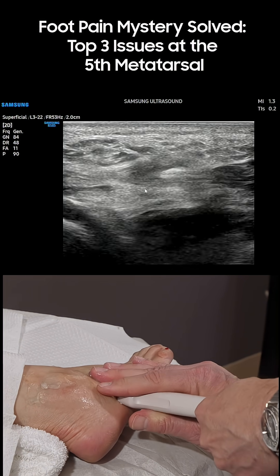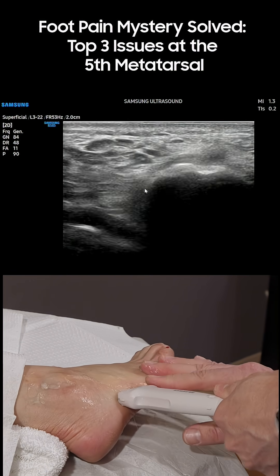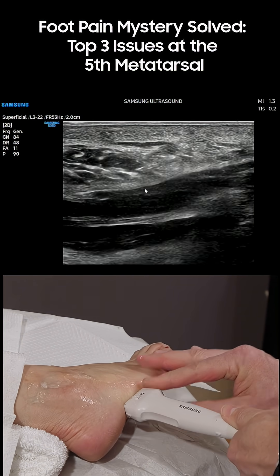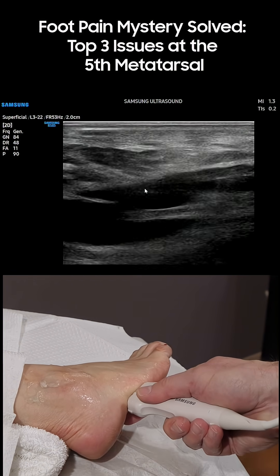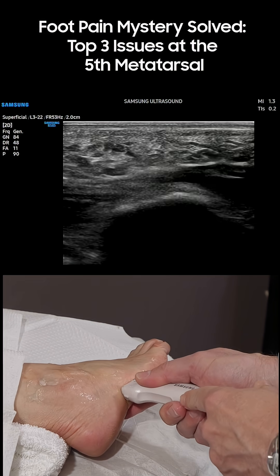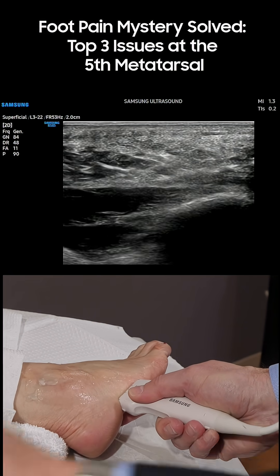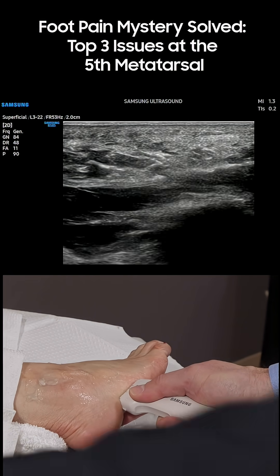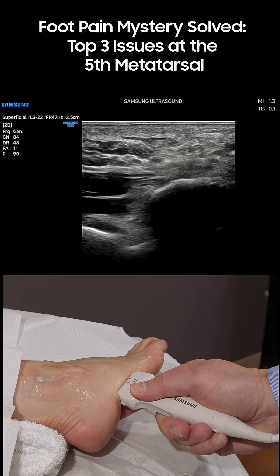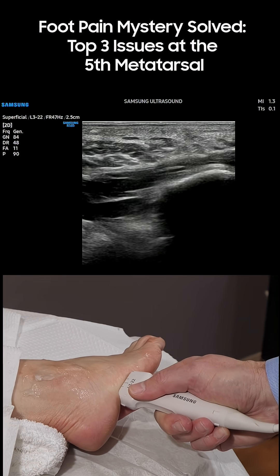Coming around more plantar like this will give us the appearance of the normal plantar aponeurosis, and then we can angle the transducer slightly toward the center or the calcaneus to look at the entire aspect of this attachment of the plantar aponeurosis.